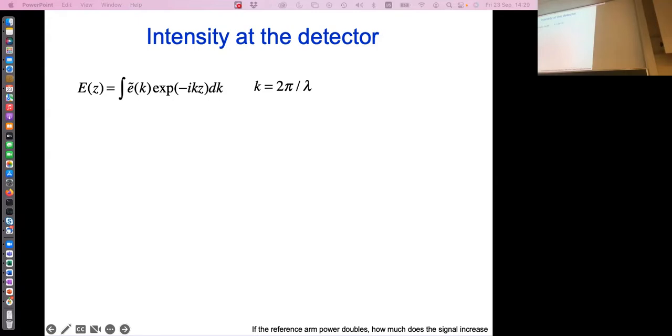What I would like to do is describe how the interference pattern comes about, starting from scratch, from electrical fields that travel a certain distance and have a certain phase, and how the spectrum then creates this localized shape. So what I wrote down is the E field as a function of depth location z on the scene. And I write that in this form here. So what does this form mean?